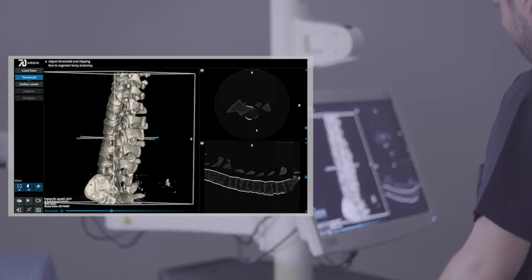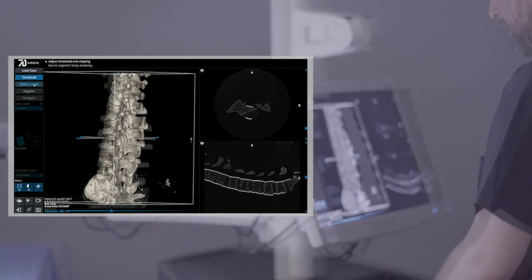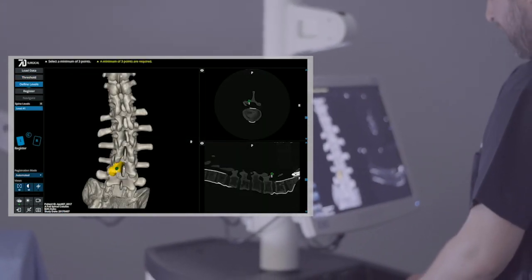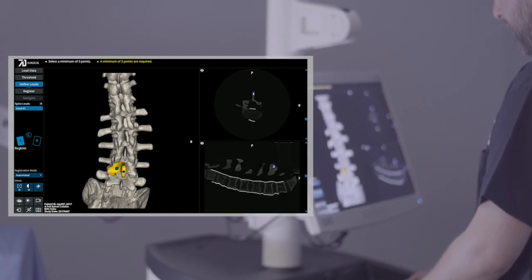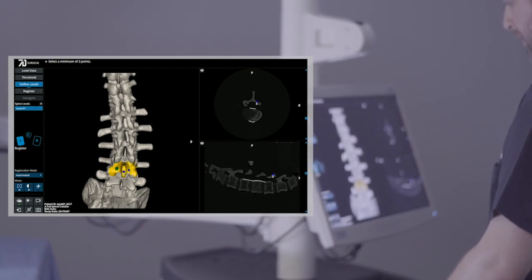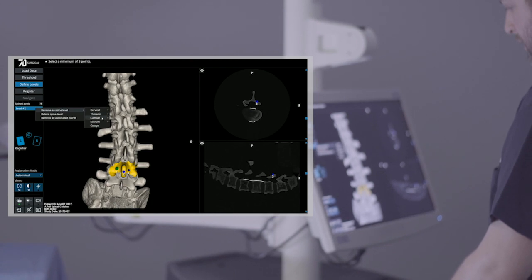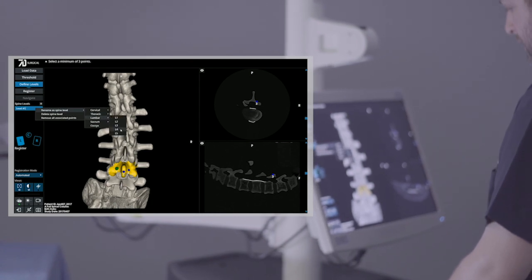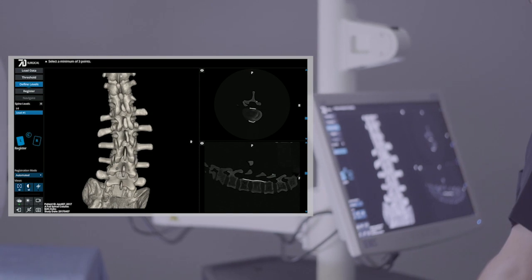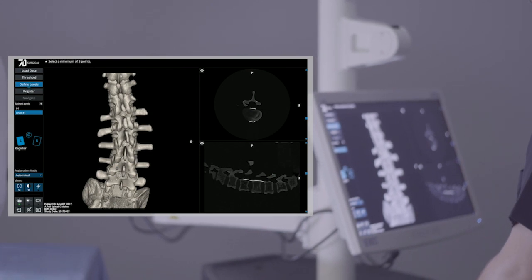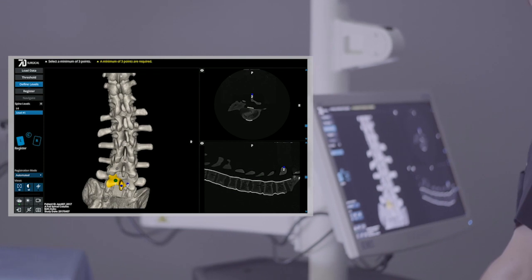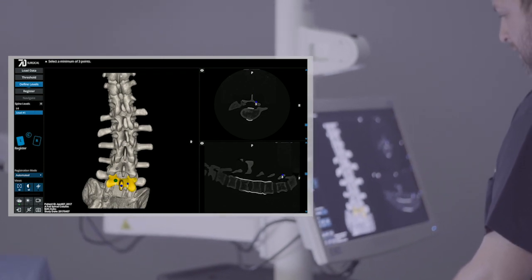The next step is to define the spine levels of interest. Here we select three points on each level that will be navigated. As we place each point, you will notice that a yellow area is automatically identified. It is this anatomical area that the machine vision cameras will look for in making a match to the pre-op CT. Each planned level can also be labeled. In this workflow, we will navigate L4 and L5.